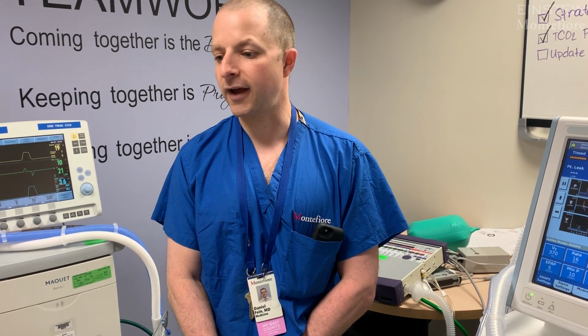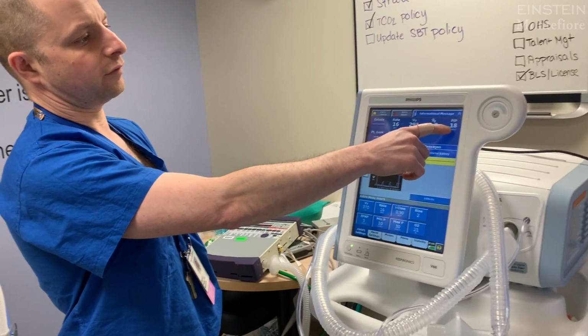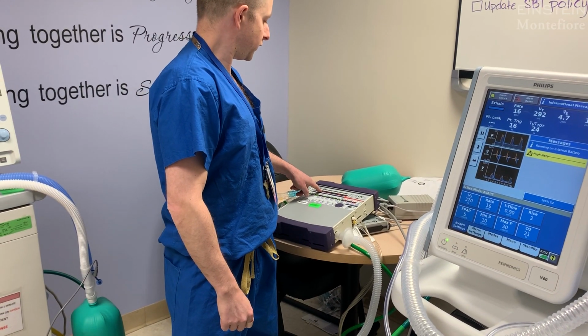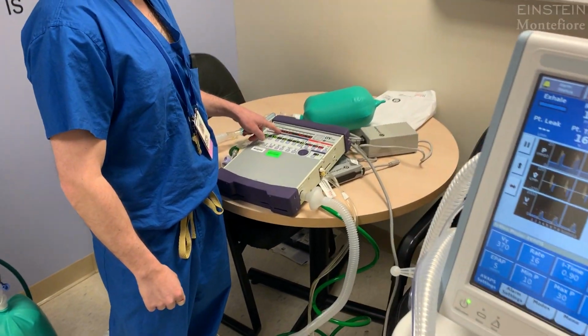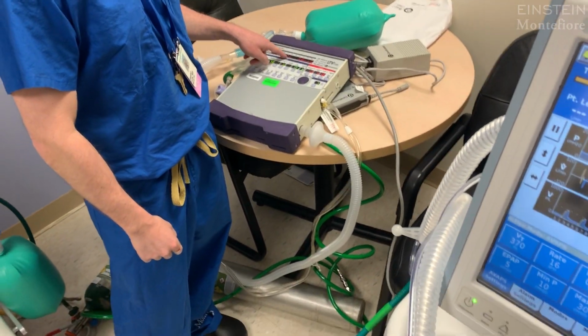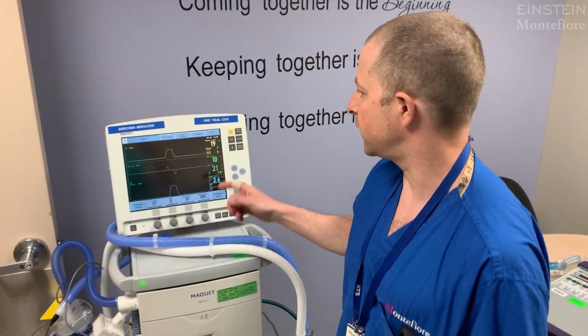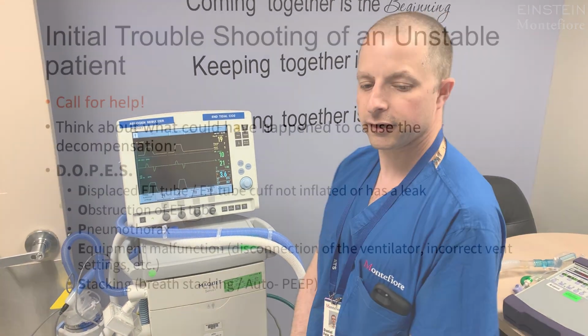Oftentimes this can coincide with high peak pressures, which on the V60 you'll find in the top right corner. On the LTV there'll be an alarm, and you'll see that in this output window it'll tell you that the pressures are high. And then on the Maquet it'll also alarm and show you that the peak pressures are elevated.